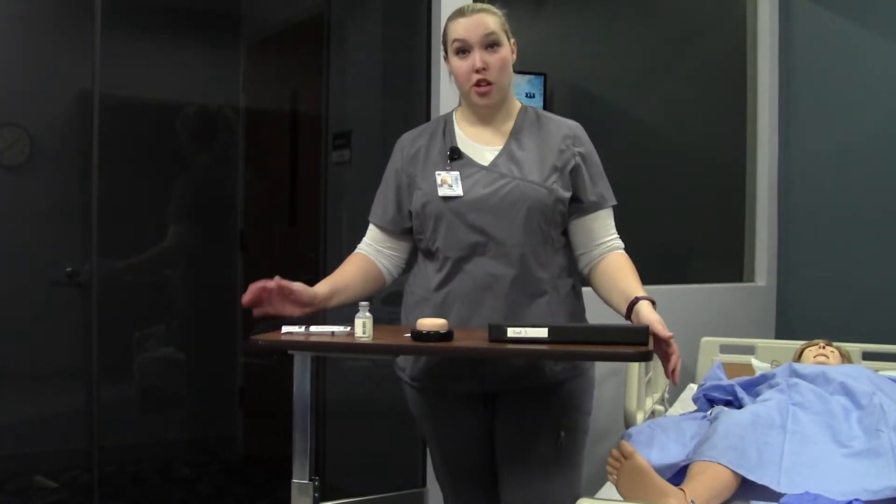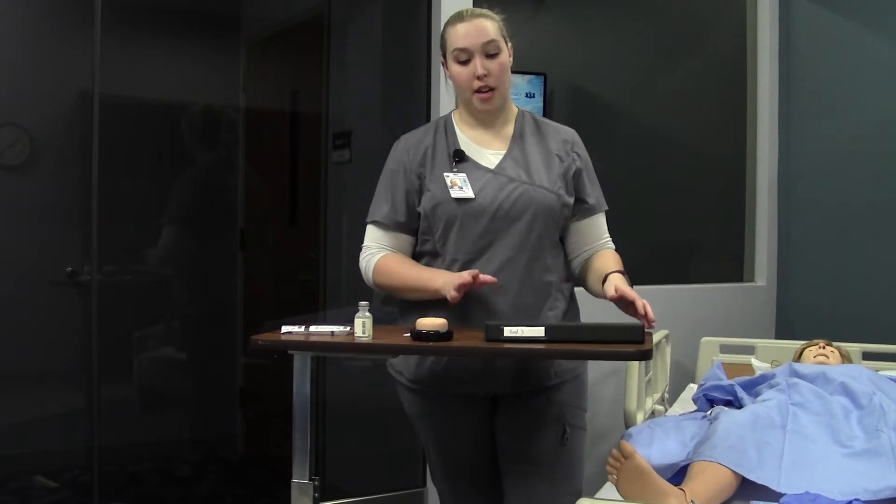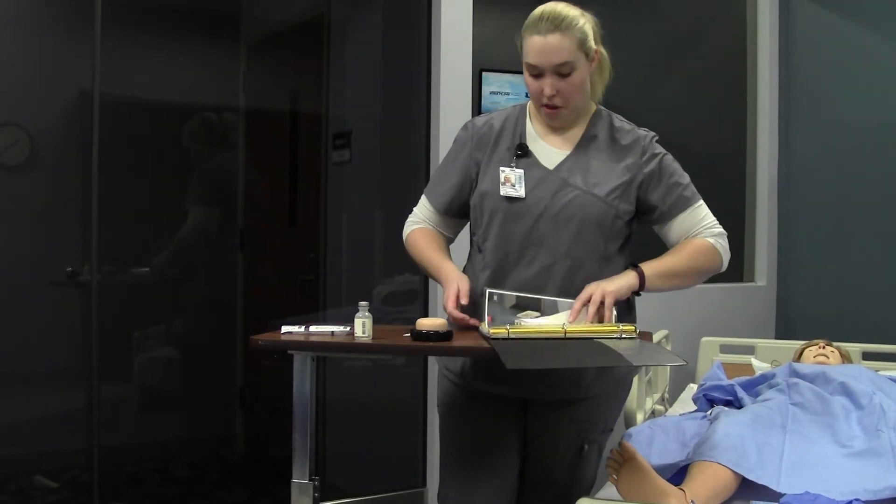All right, the other sub-Q injection that you can do would be heparin. So I'm going to make sure I check my MAR to make sure that it is due.